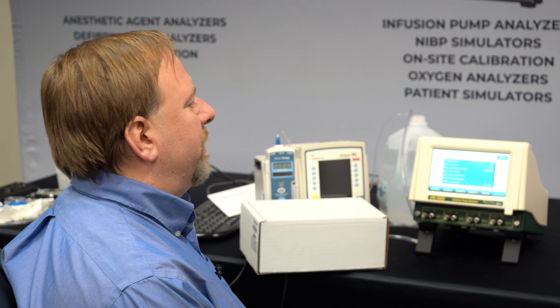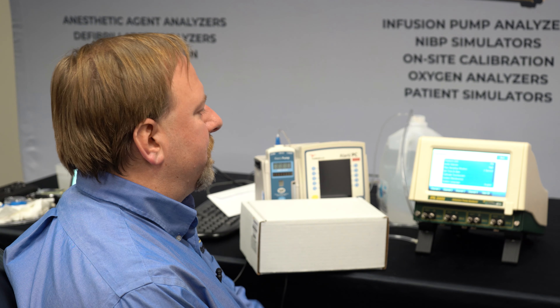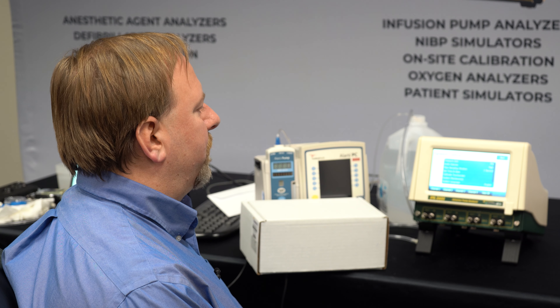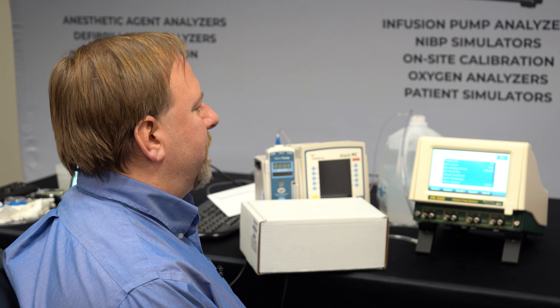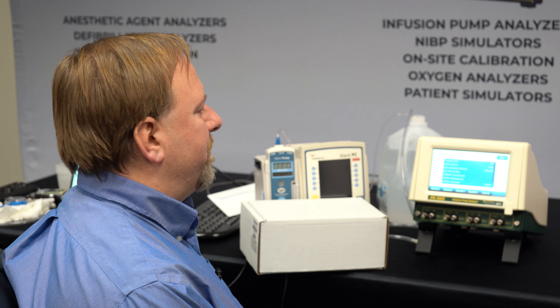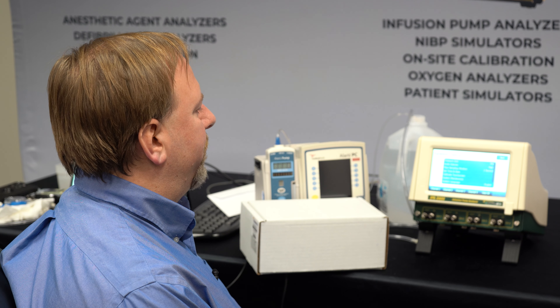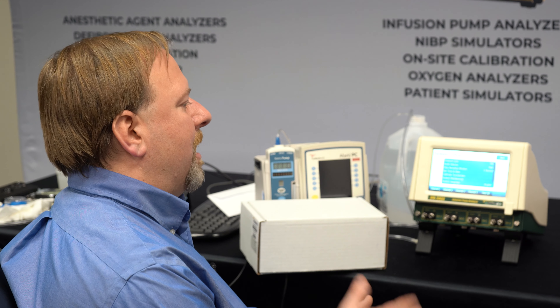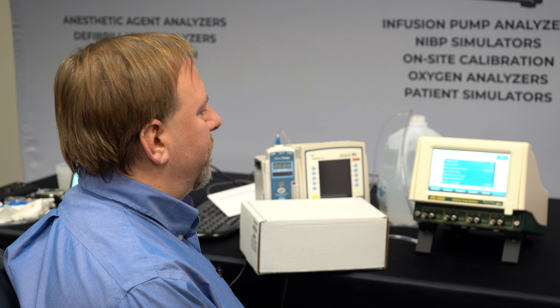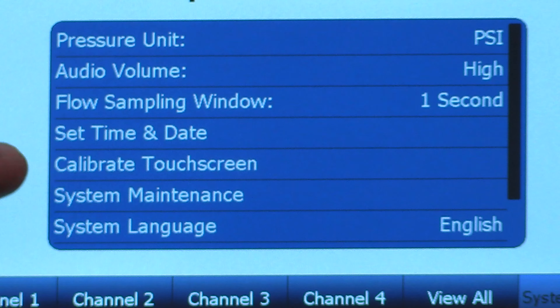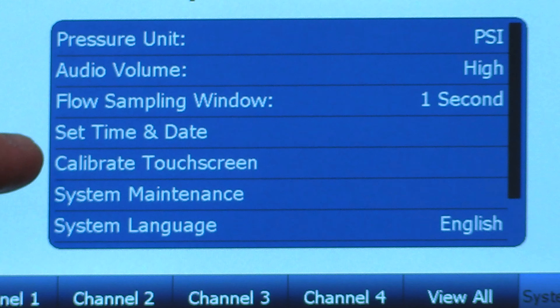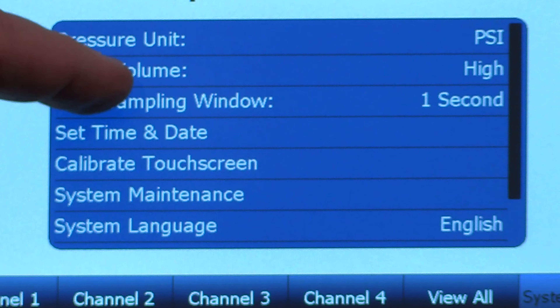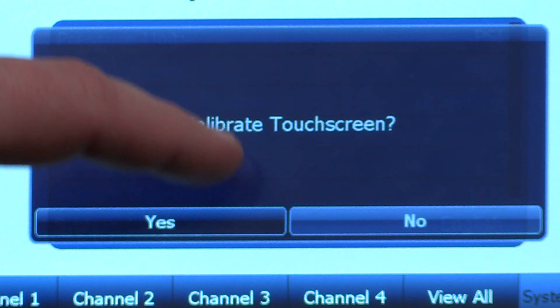It allows us to do system setup such as the pressure units that we want to display and the audio volume for the key clicks. The sampling window is how often we store readings as the flow test is running. So if we're running a really long flow test, multiple hours, we may want to extend that out to a longer period of time just to reduce the amount of data that we have. It doesn't change the rate at which we measure the flow rate, it's just how often those readings are saved to a file.